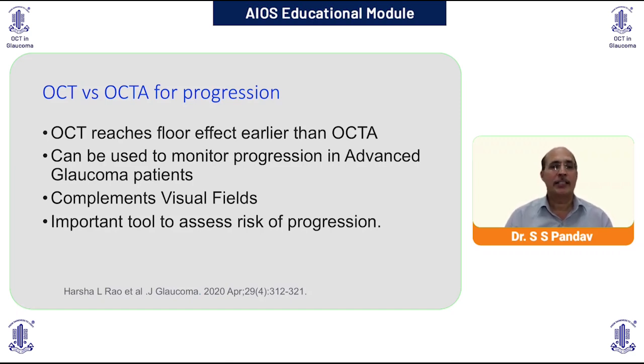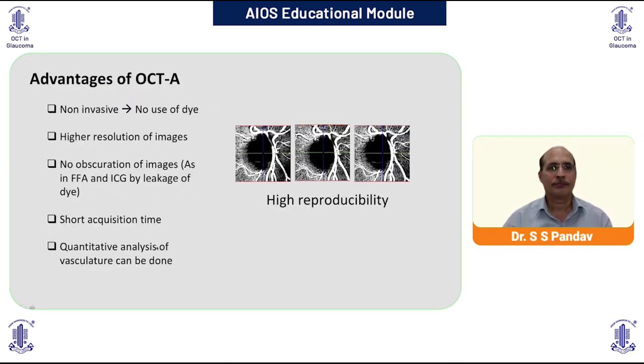And in that sense, it complements visual fields. Visual fields, as we know, are better than OCT in monitoring progression in advanced glaucoma patients, and OCTA complements visual fields in that respect. And also, as we know, it's an important tool to assess risk of progression as well.